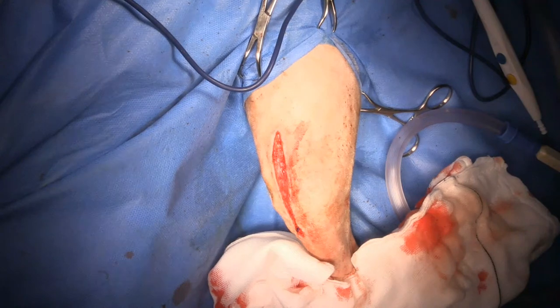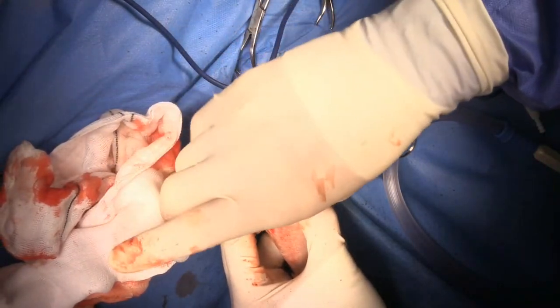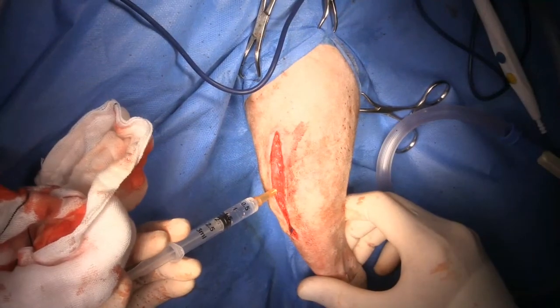I usually do just a tibial crest transposition to start with, and then if necessary I'll go and do a trochleoplasty as well. Some people take the opposite approach, but I feel like you need to align it first. I tend to use just pins while maintaining that distal periosteal attachment in place, and that's usually enough - although this one I thought was a little bit more mobile than I'd like, so I went ahead and put in the tension band. I'm using prolene because I'm counting on that repair of the fascia lata to last longer than the four to eight weeks that PDS lasts, so that's why I'm going with a non-absorbable suture material.